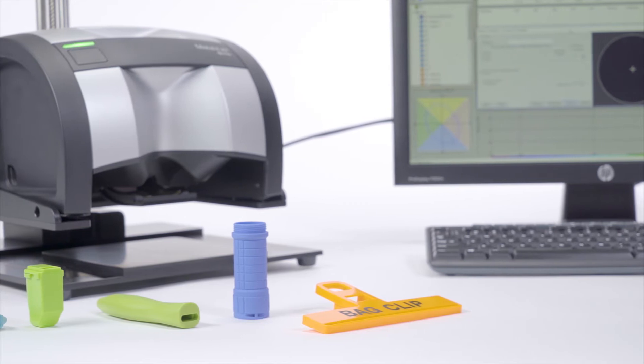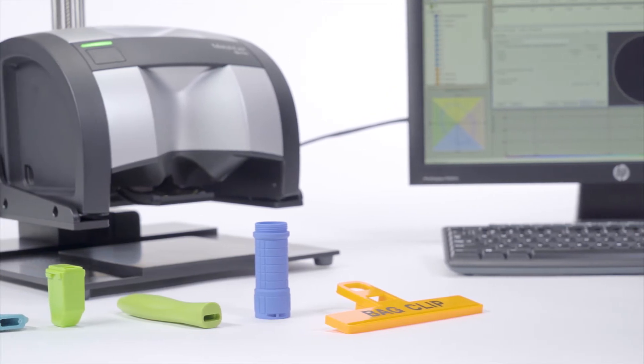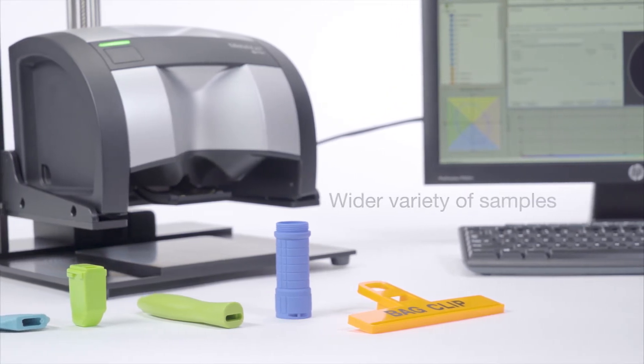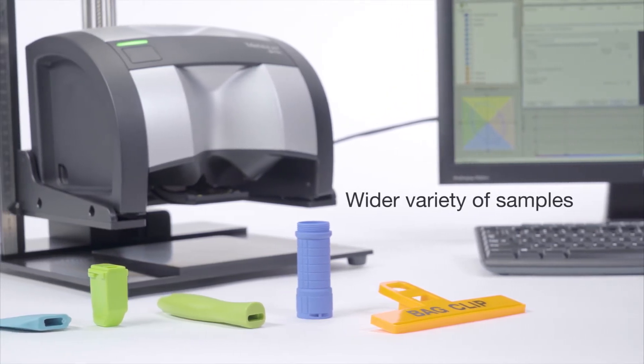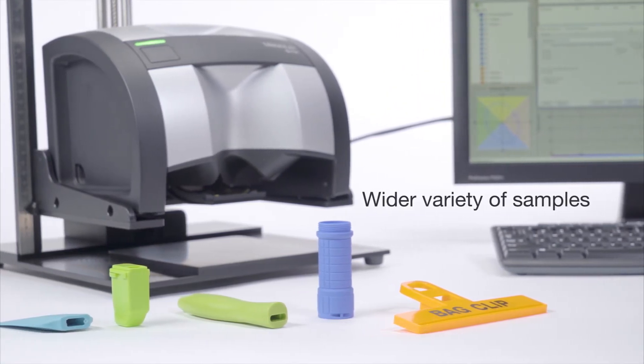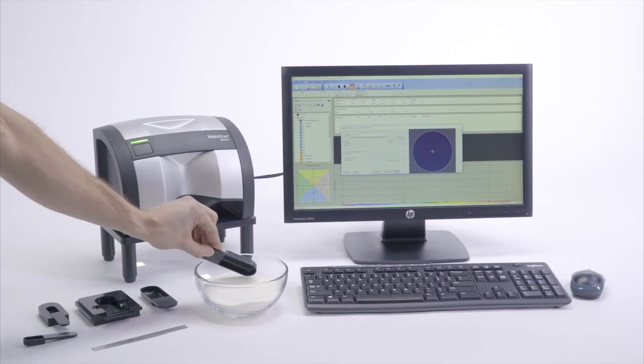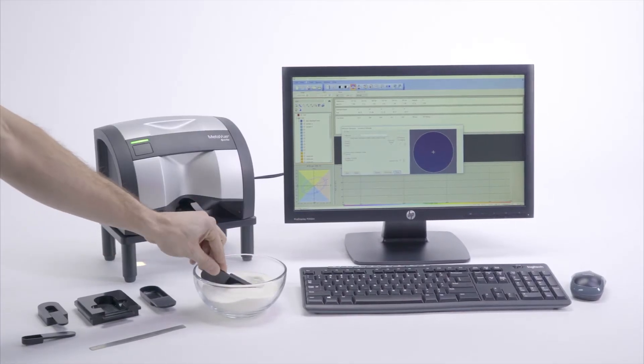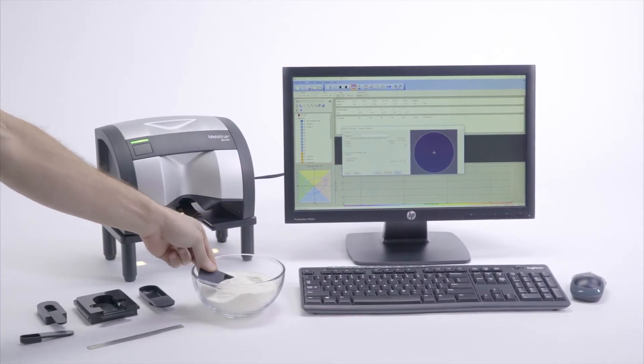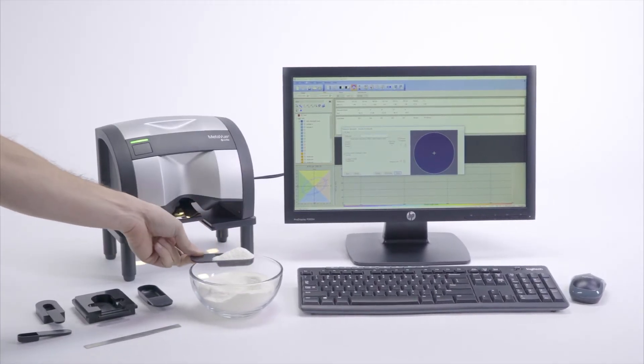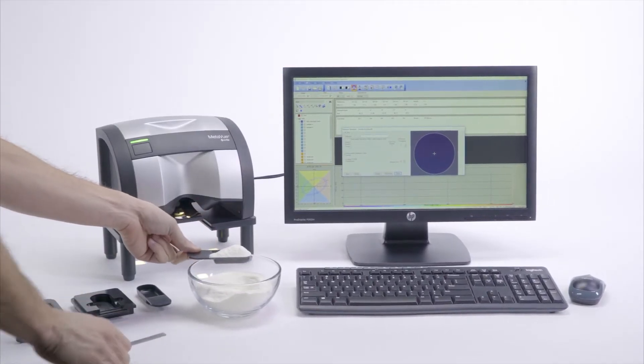Now you can implement quality control or create lab matches from a wider variety of samples than ever before, enabling you to perform instrumental QC where only visual QC was possible.